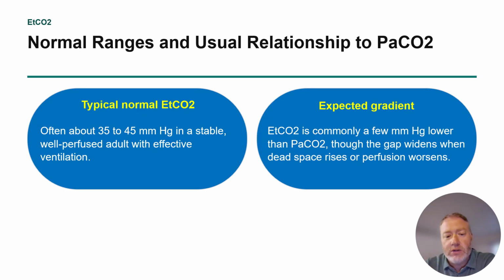So if you're trending somebody who, let's say, is intubated and on an end-tidal monitor, and you're used to it reading around 40, you would expect that their PaCO2 would be a little higher than 40. But if you were to get a gas and compare the two, and then a few hours later get a gas and compare the two, if the difference between the two is greater, it doesn't necessarily mean that it's a respiratory issue.